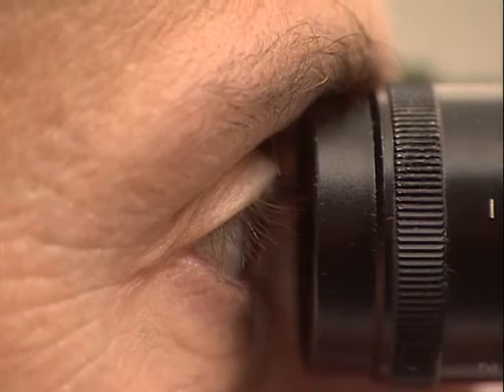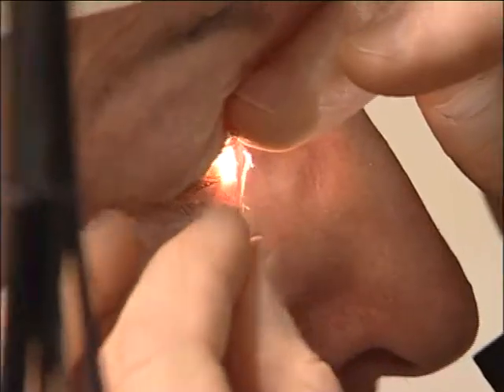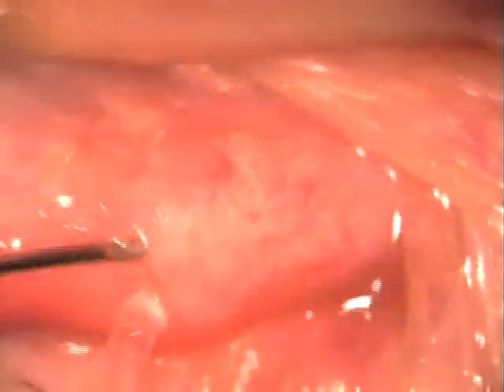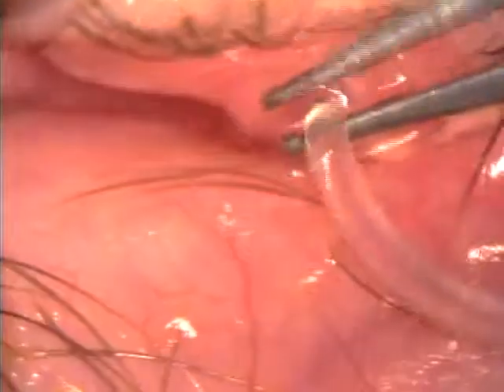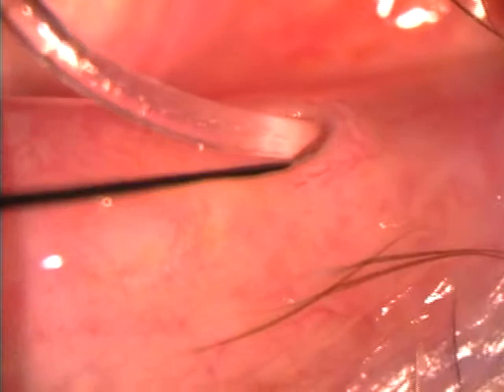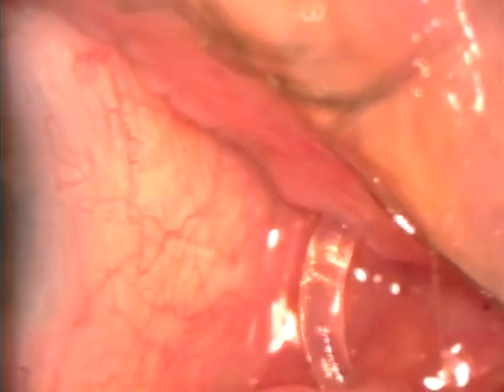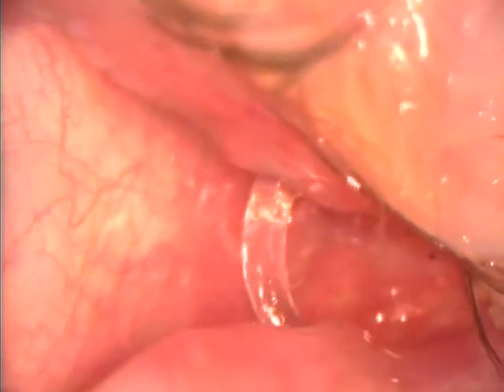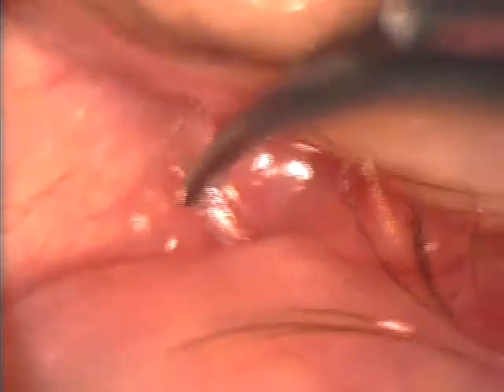Some practitioners prefer to use the slit lamp due to its ease of use and its presence in the consulting room. The technique is the same, with insertion via the superior meatus and then via the inferior meatus. This technique may offer a better view of the position of the central mark. Because of the rapidity of the insertion and the fact that it is virtually pain-free, patients have no idea of the importance of the procedure they have just experienced.